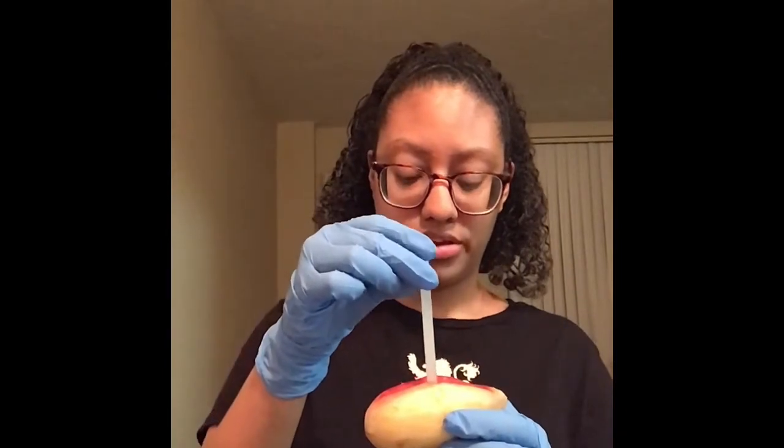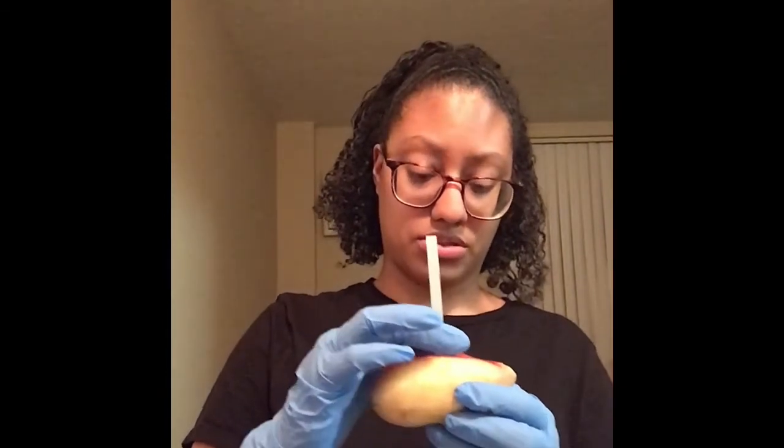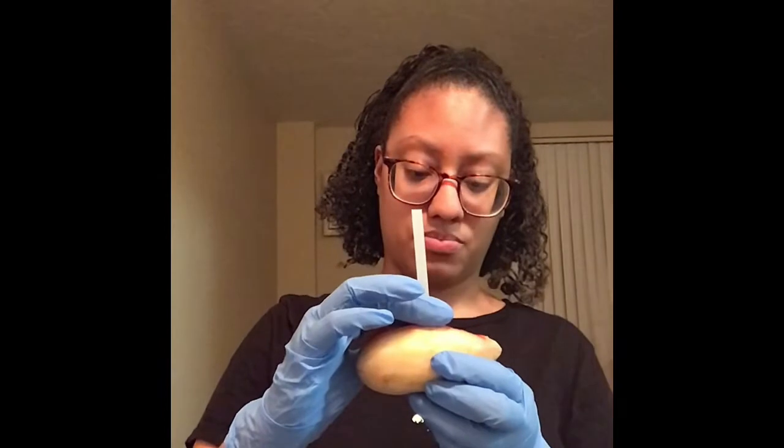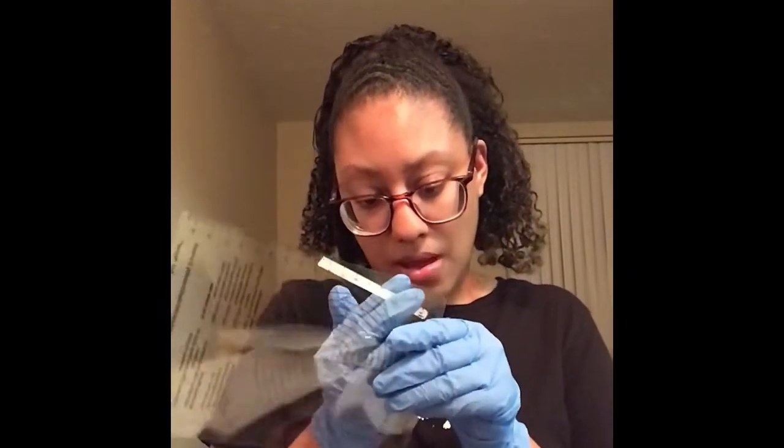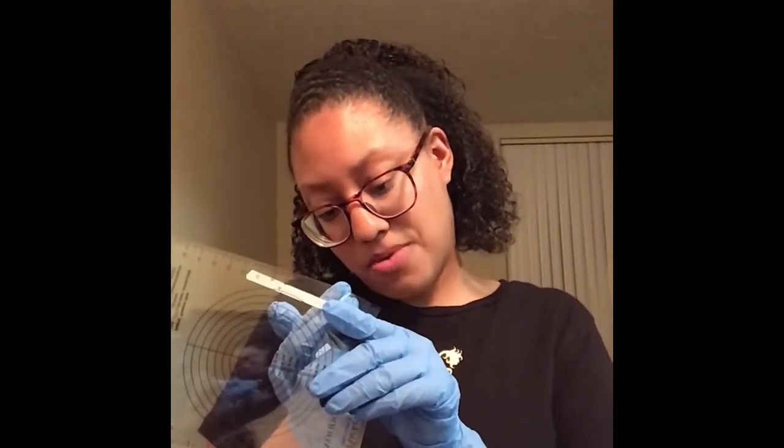After we've measured the length and the width of your wound, you are going to grab your sterile swab, and you are going to take your swab into the deepest point of the wound. Line your fingers up with where the wound stops. You're going to take it out, and you are going to measure the length of your swab, and that is about 2 centimeters.